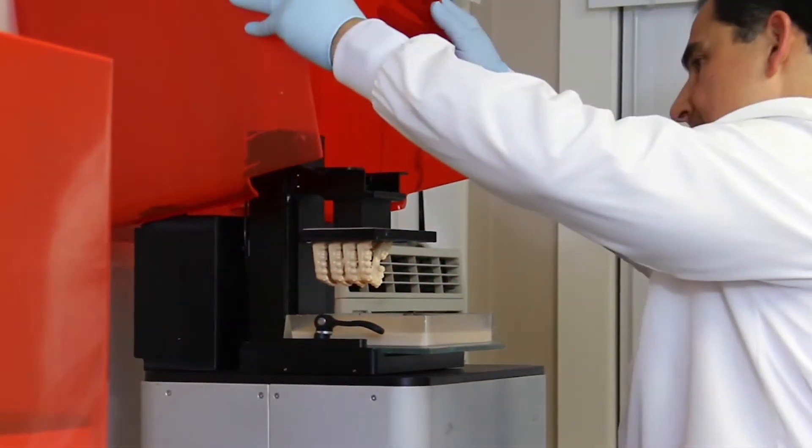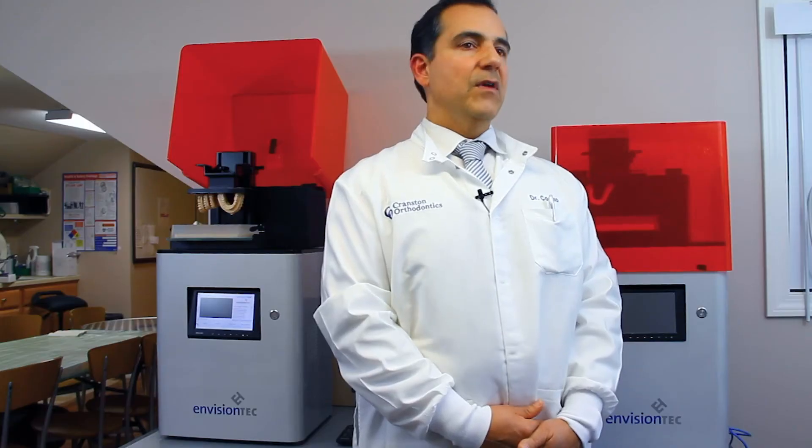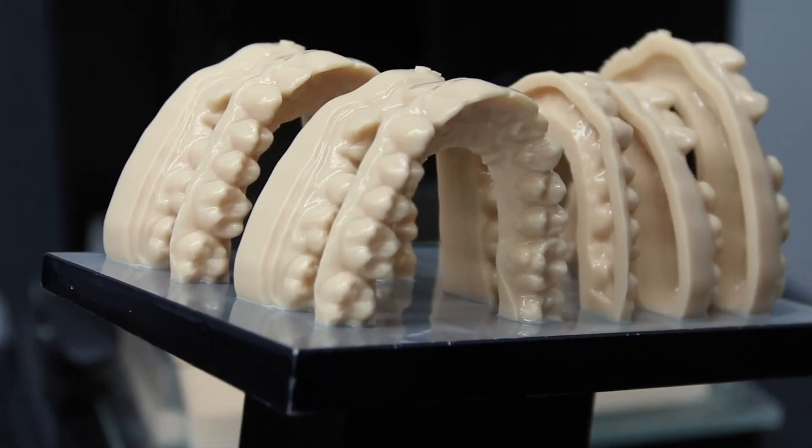The EnvisionTEC Vida is simply an amazing tool that we can't live without. That's why we purchased two, and now we're going to be purchasing probably another two because we're so dependent on it. It is the foundation of our office and it's simply incredible.